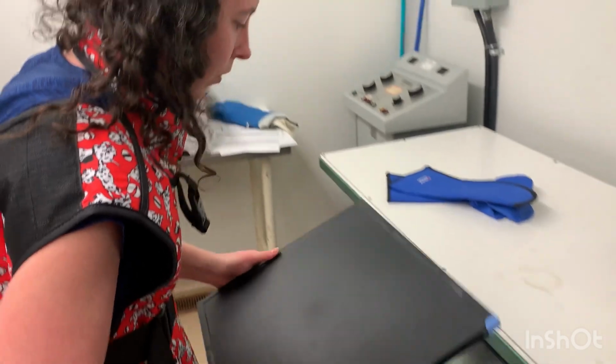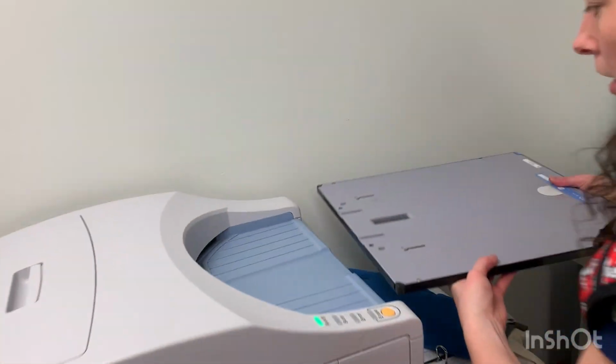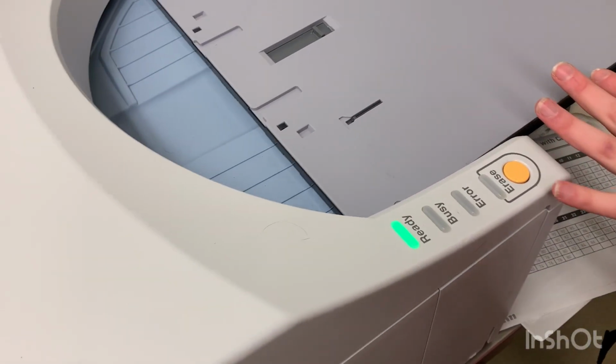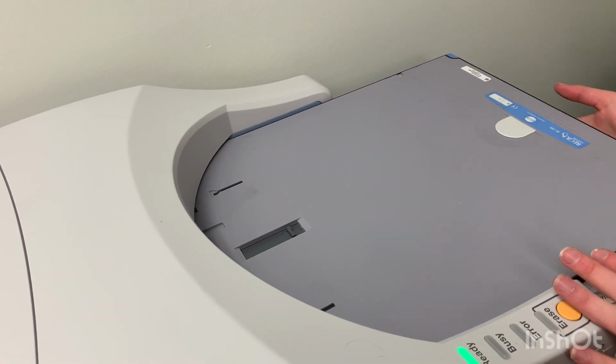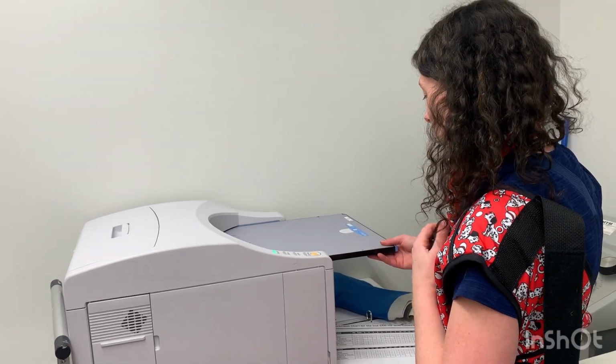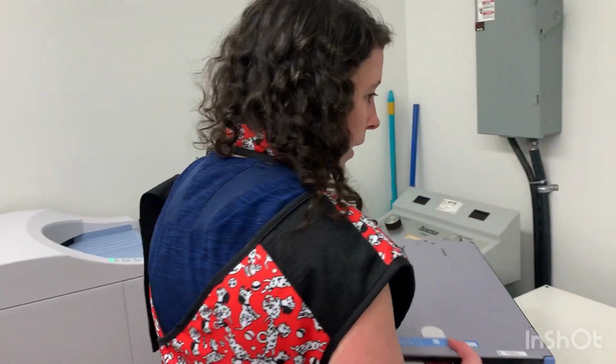Really important to be careful, don't drop these. And then it says ready. You can see the arrows in here. We would put it in here to be processed again, and explain how that works. And then we would go over and take a look at our computer and see that we're happy with the image. So that's how we would go about that process. So then we would have those two images taken.